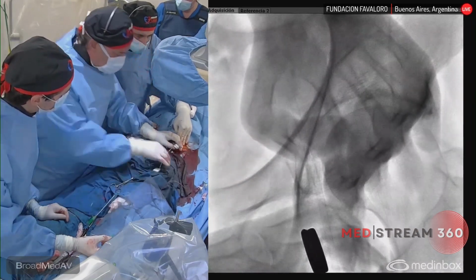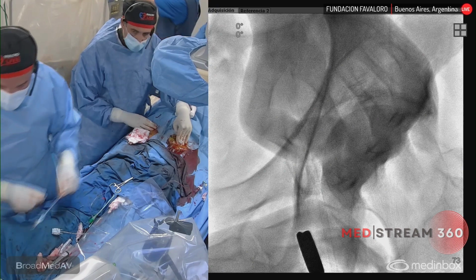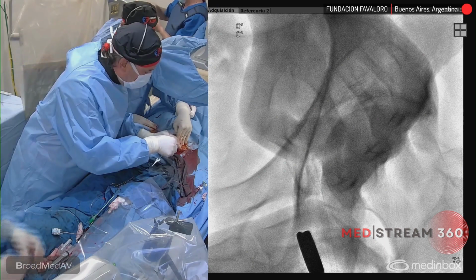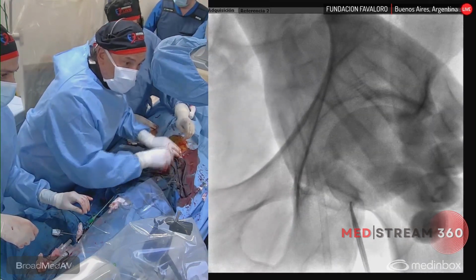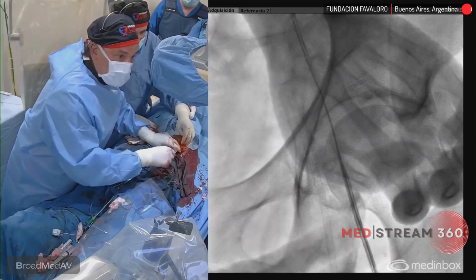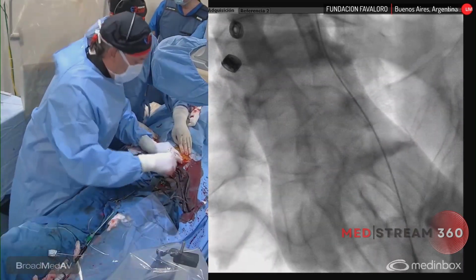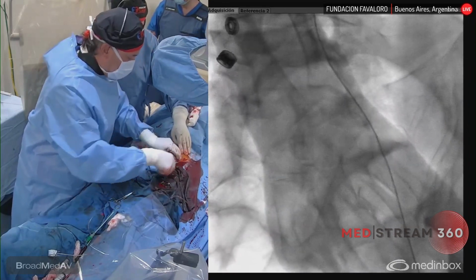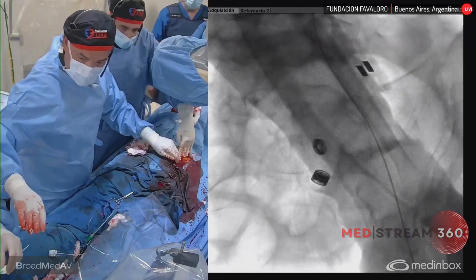Let me see if I can introduce the wire. Give me another 8 French Angio-Seal. Give me the Amplatz wire again, or the sheath. Okay. There is a kink there. And this was my problem. And this was the reason why. Mostrame arriba. I couldn't introduce completely. So now I'm going to leave. So there's a problem with the Angio-Seal.